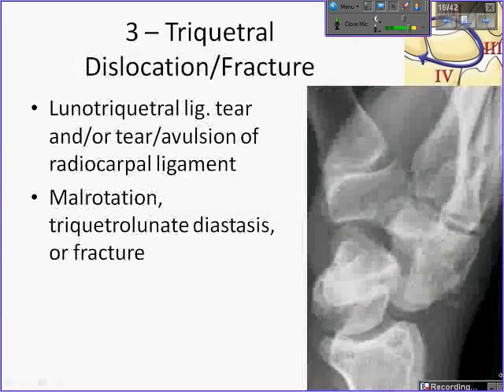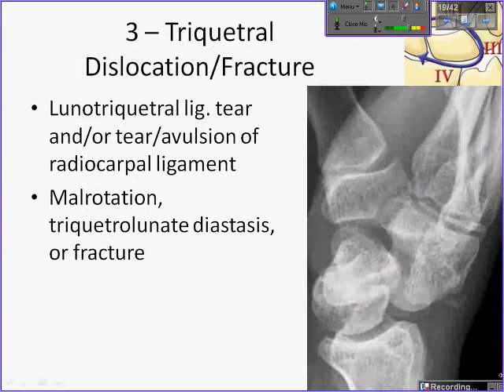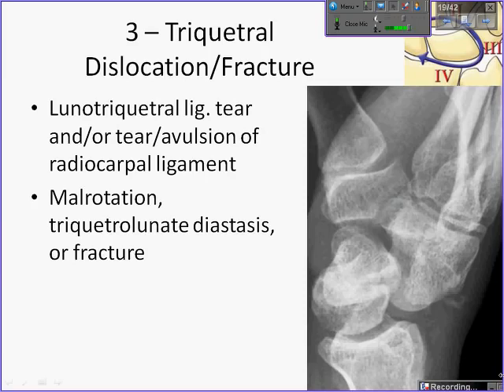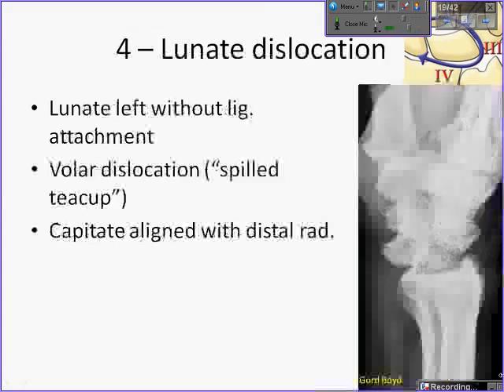The third stage of perilunate instability is triquetral dislocation or fracture. You can have disruption of the lunotriquetral ligament or the volar/dorsal extrinsic ligaments about the triquetrum, with avulsion of bony fragments. The triquetrum may be unstable or malrotated. You may see triquetrolunate diastasis or fracture — though not commonly. In this case, you can see a triquetral fracture dorsal to the carpus.